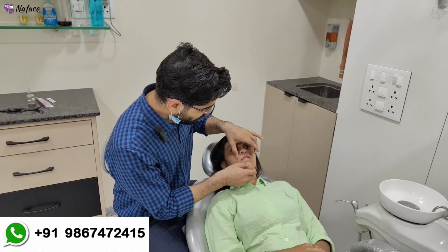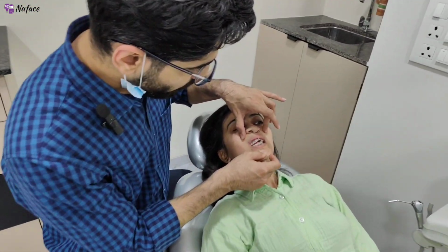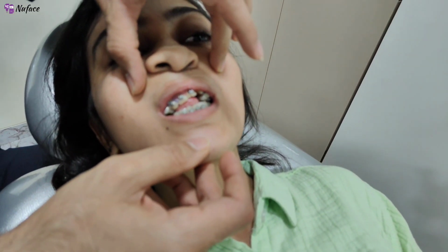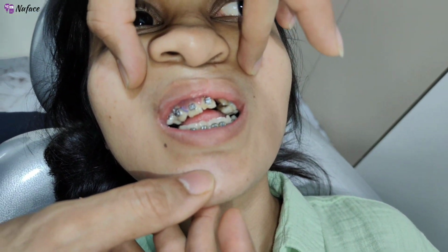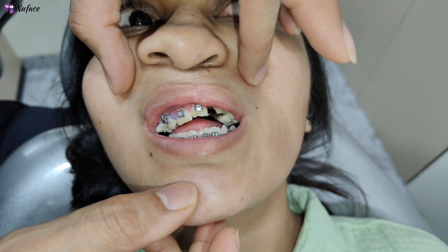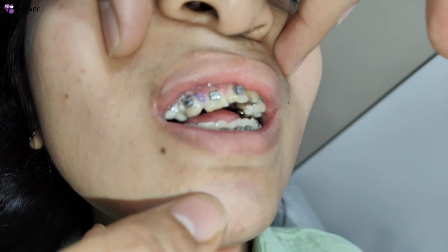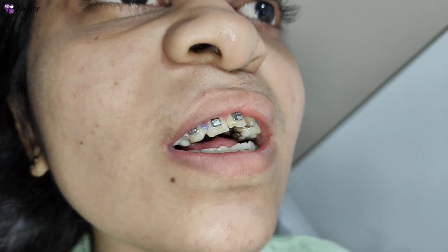profile. Also, if you can see, we have been able to manage to jump the bite. The maxillary segment is going into slight open bite, which is expected with anterior maxillary distraction. But if you see, the jet is more or less achieved, that is a positive jet is achieved. Another 2 to 3 mm of overcorrection and we will stop the distraction.